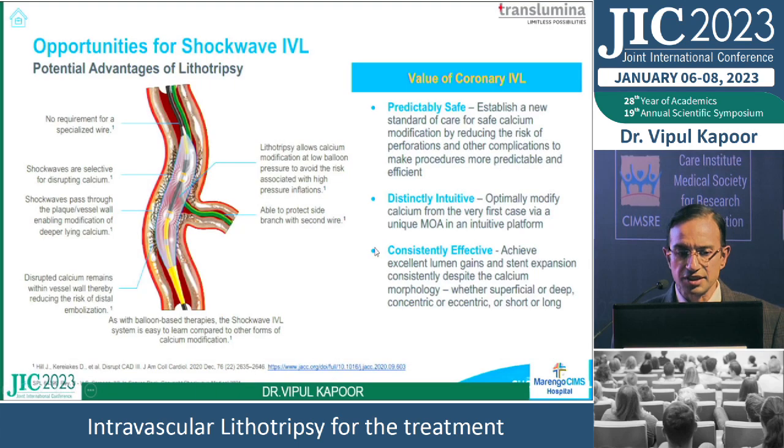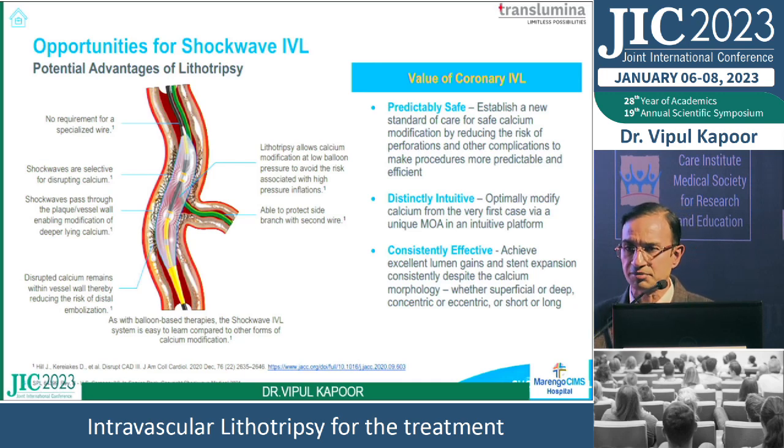So as you can see, it is a very simple technology. It has a balloon, and in this balloon there are emitters placed. So this lithotripsy is quite similar to the one which we are very well versed with from our urology friends, isn't it? There you are breaking stones, here you are breaking calcium. So what it does is, it is just meant to fracture the calcium, and once it is fractured, then it becomes easier to expand your balloon to actually compress the calcium, and then your balloon and your stent can expand. So it is not pulverizing.